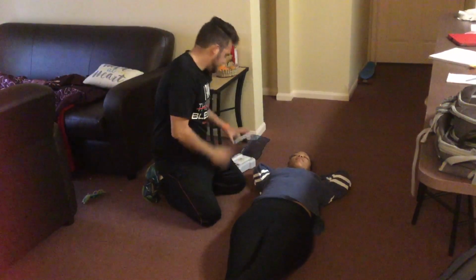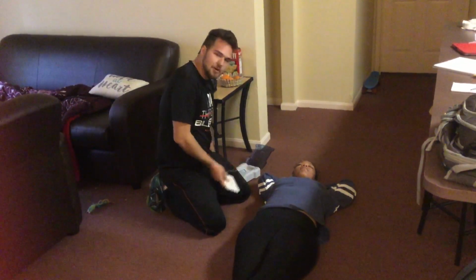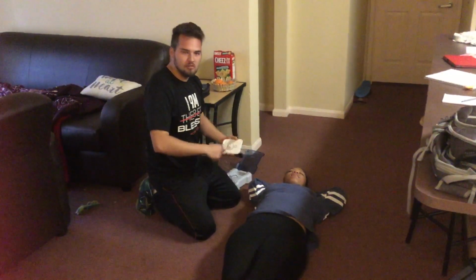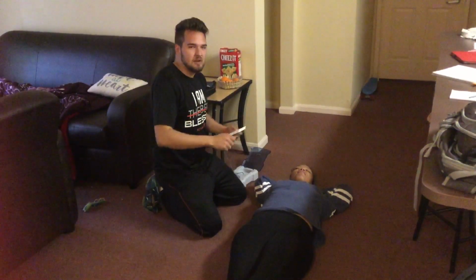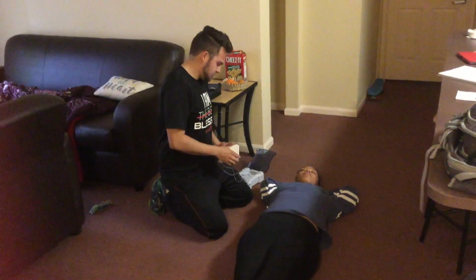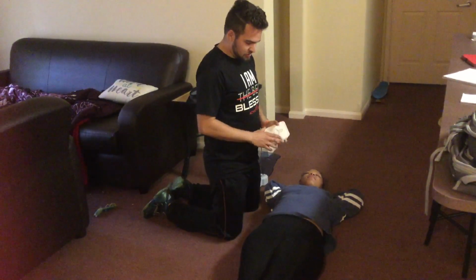And so at this point, my imaginary person got the AED, so I would begin by hitting the power button. Remove clothing. At this point I should already be removing clothing by the time I ask for the AED. Once I ask for that AED, I should be removing that clothing, so that I don't have to stop giving my CPR just for that. So begin with the pads. Make sure I put them in the right spot. It's kind of dummy proof because it shows you right where you should be putting the pads.